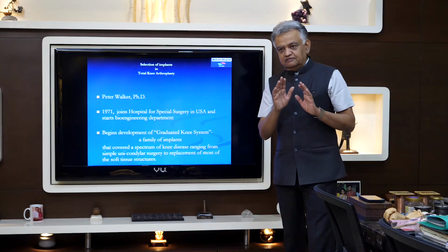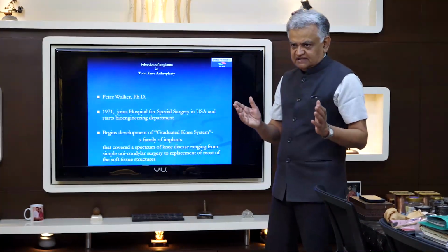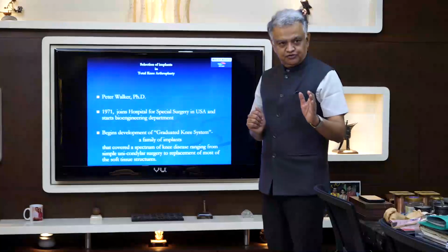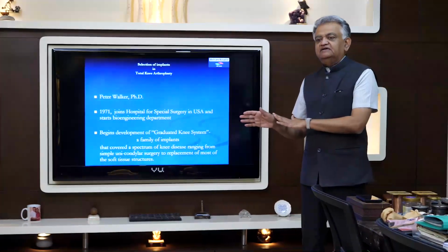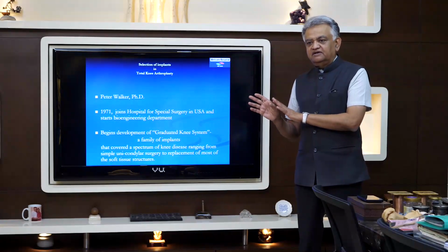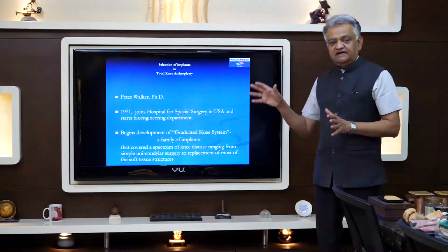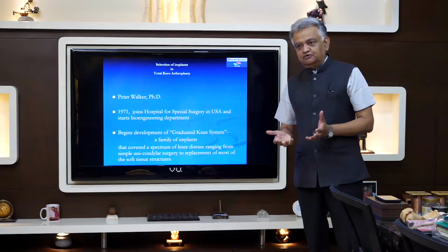Later on, it was realized that perhaps trying to save the anterior cruciate was a non-starter. So later on, it graduated down to the anatomic line of thought trying to preserve the posterior cruciate, whereas the functional line of thought was about sacrificing both cruciates, not being rigid about trying to maintain the normal anatomy of the human knee. Instead, try to improve the function of the human knee rather than trying to preserve the normal anatomy of the human knee as part of the act of arthroplasty.